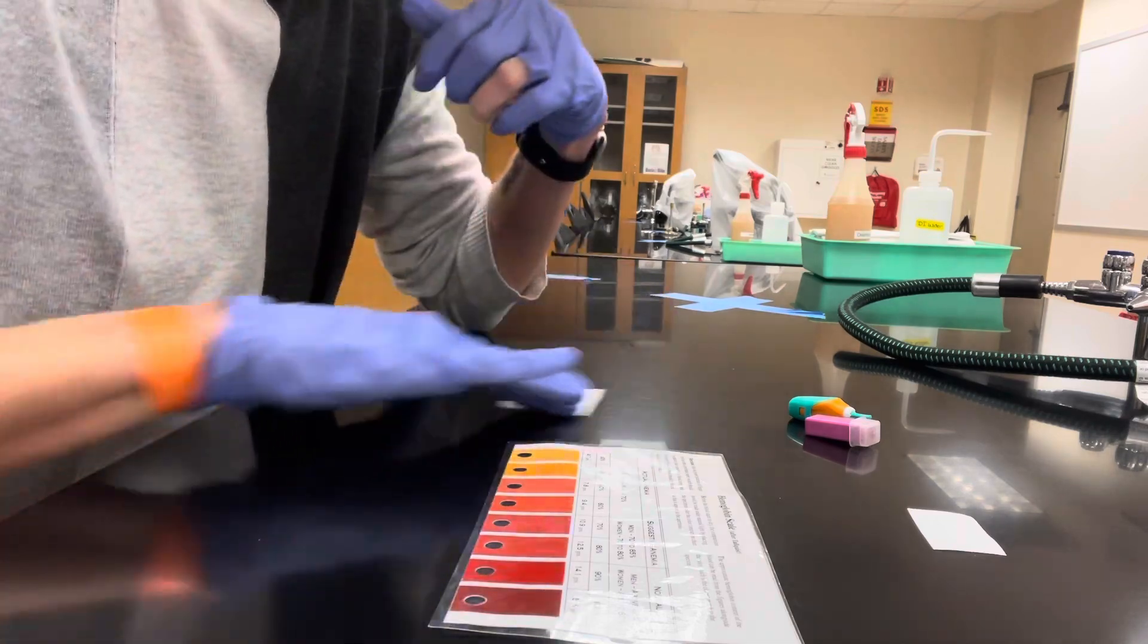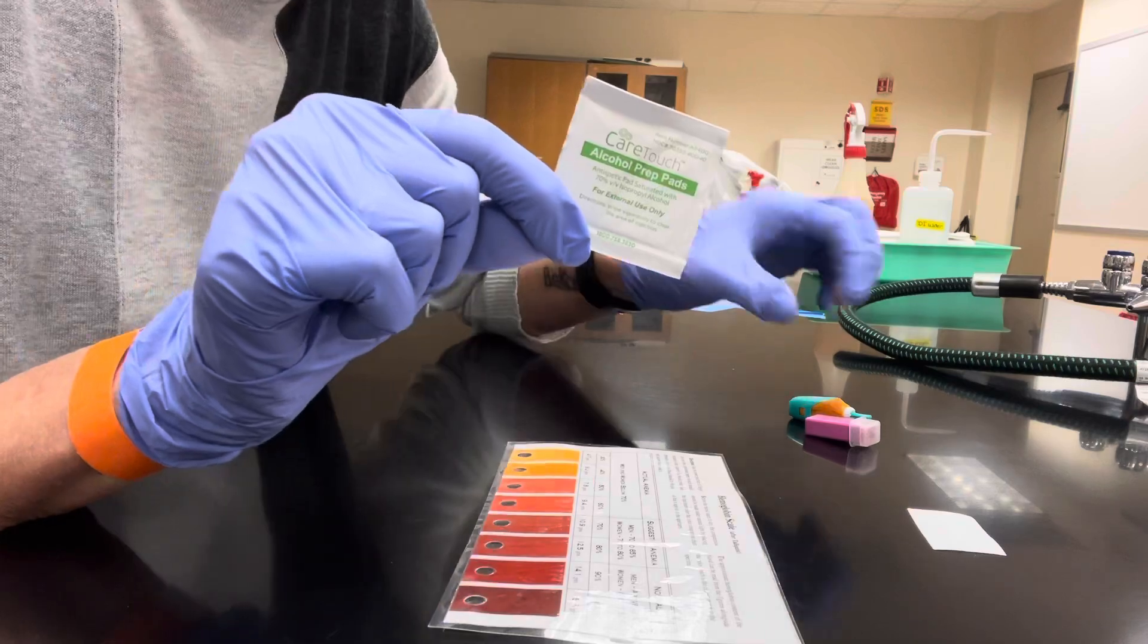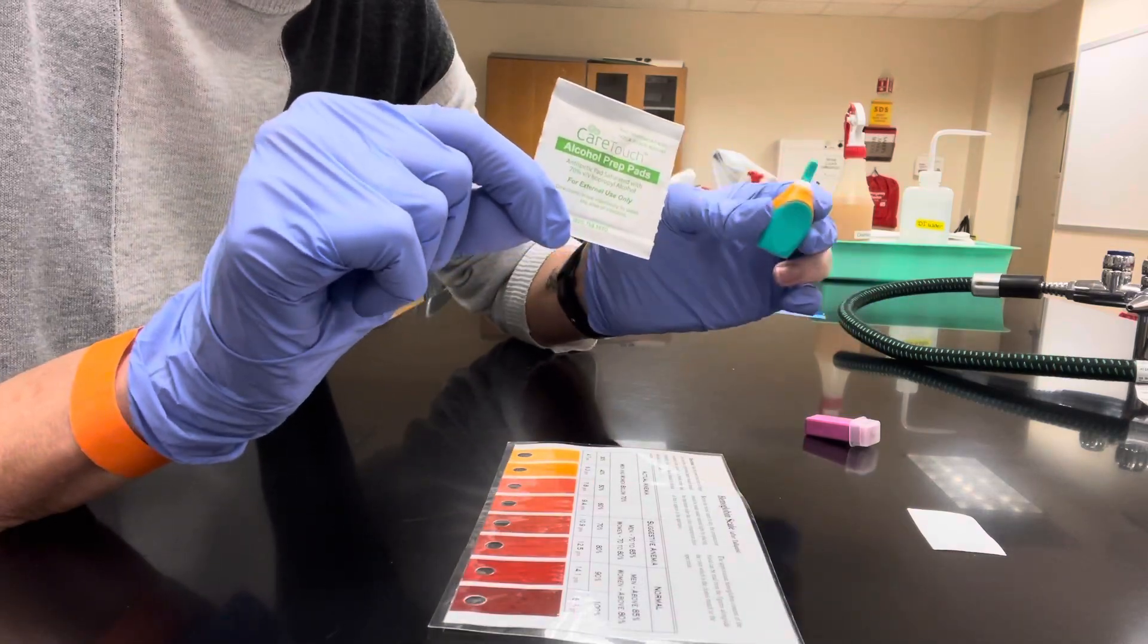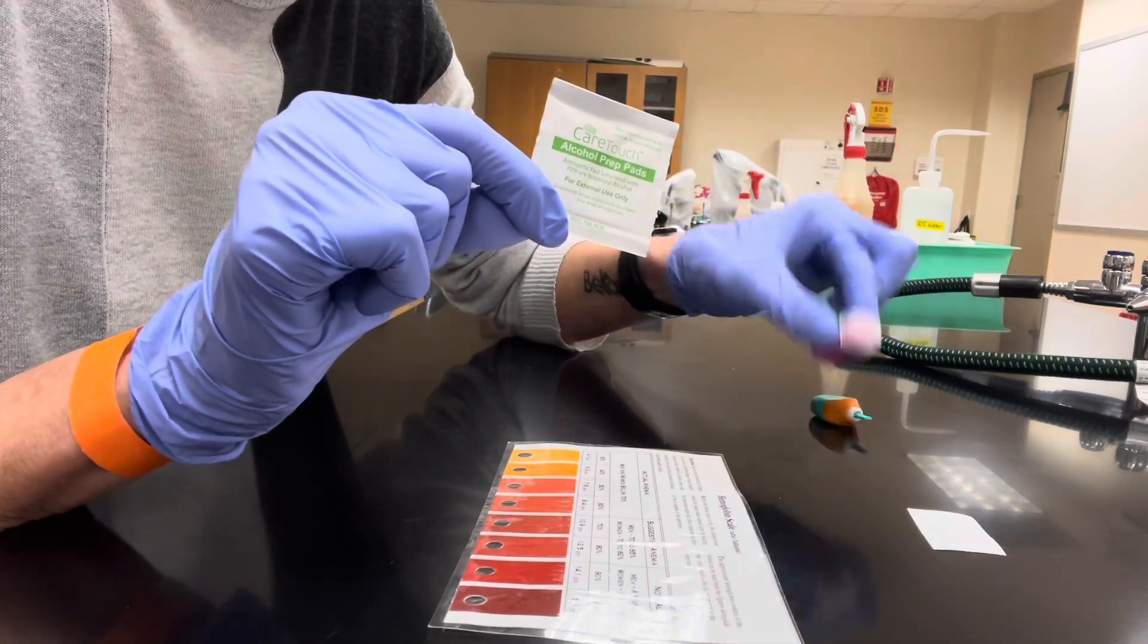So in your kit, take out an alcohol towelette, a lancet. It could look like this, or it may look like this.